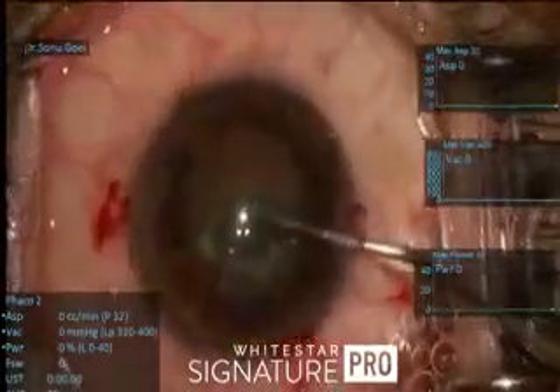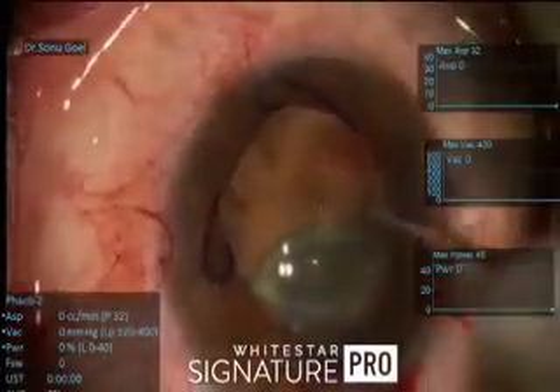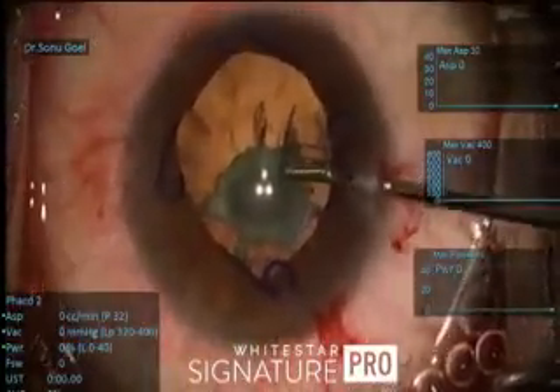This is how the view looks like — viscoelastic there, and there is a large opacity in the center. It could be a polar element, so we are very careful. An ideal size rhexis of around 5.5 millimeters is what we are aiming at. Now this is a young female, so the micro rhexis forceps comes as an aid through the side port.